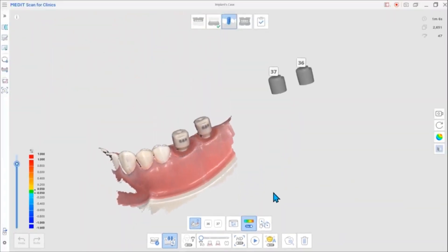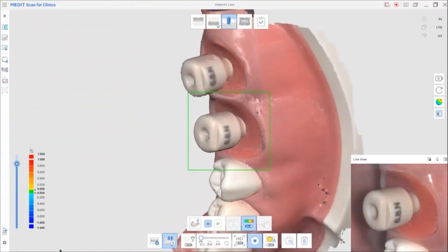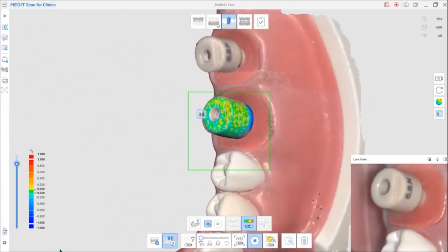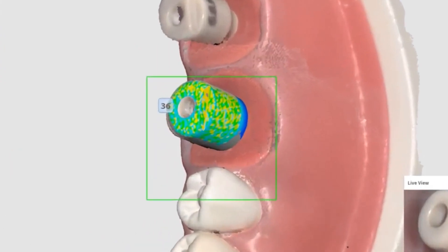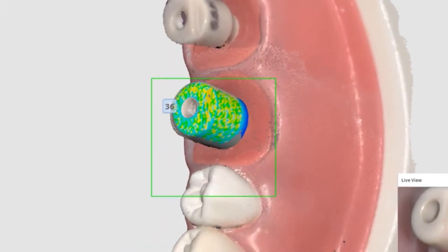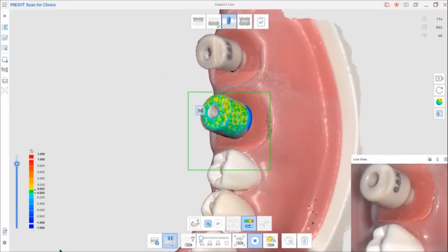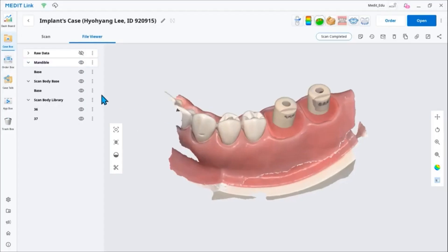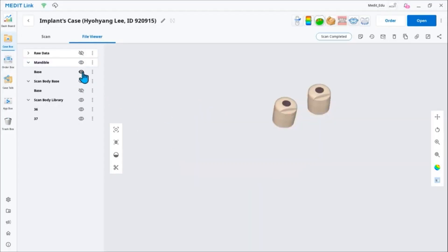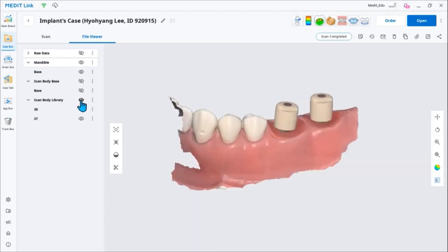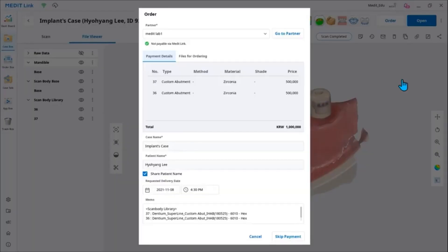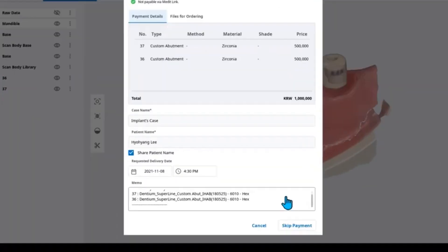If you already have a library assigned like on the screen, the library will be automatically sorted. A separate file in MeditLink's file viewer will be created when the scan is completed and saved. You can send this file when ordering from the lab account — useful for when you need to do additional design work in ExoCAD. The library information is automatically written in the memo box for your convenience.